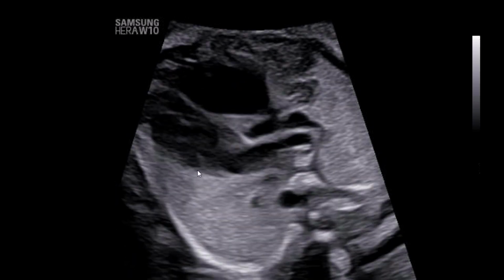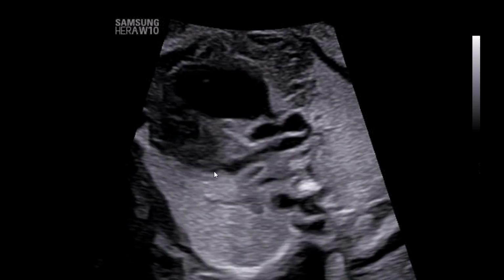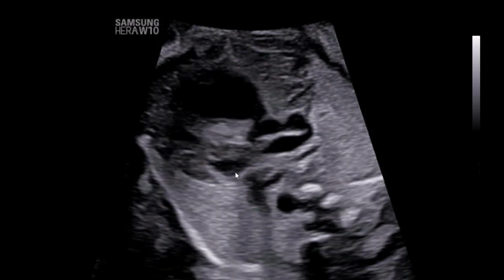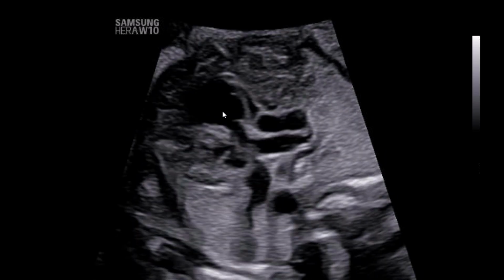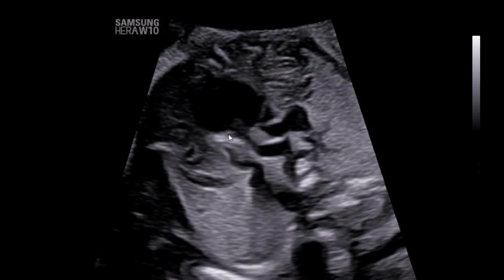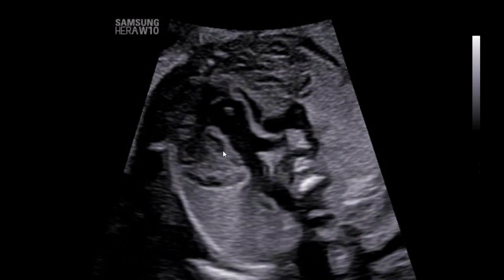And as we sweep more cephalad, we see that that outflow tract turns into a great vessel. And then the other outflow tract, RV outflow tract here, giving rise to this semilunar valve there. So this is another outflow tract. And immediately there's a bifurcation of this vessel. So we can guess or surmise that this is the main pulmonary artery with a pulmonary artery bifurcation.